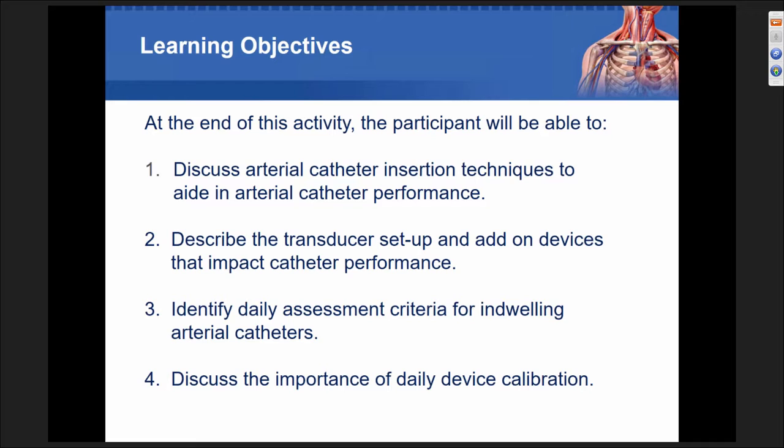The next one really is to identify the daily assessment criteria for indwelling catheters. Regardless of the catheter type, somebody should be assigned, whether it's the respiratory team if they're placing the device, whether it's the nursing team if they're placing the device, or even the physician team.